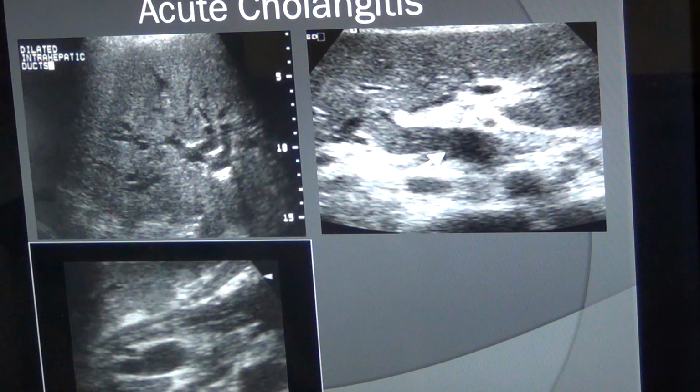At that time you will see the intrahepatic bile ducts are dilated, and those ducts are more or less parallel to each other, giving a double barrel sign, with multiple anechoic tubes. You click the color, and you will see there is no color in it. That means it is bile duct. If it is colorful, then you have to understand it could be portal vein, hepatic vein, or hepatic artery. Those are the blood vessels with color. It should be colorful, but it did not.